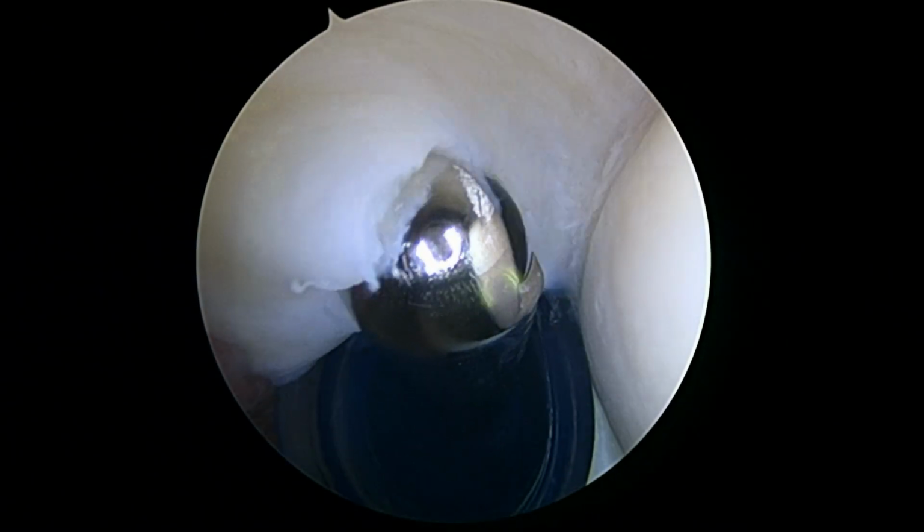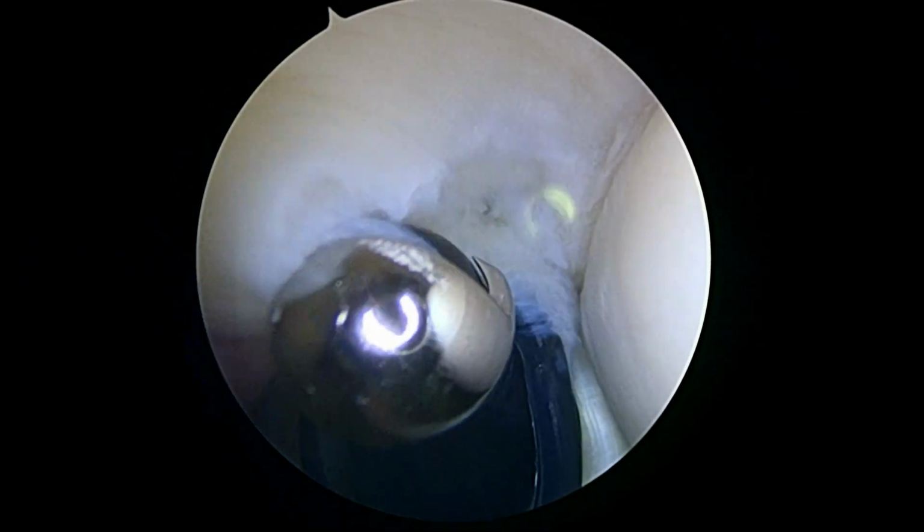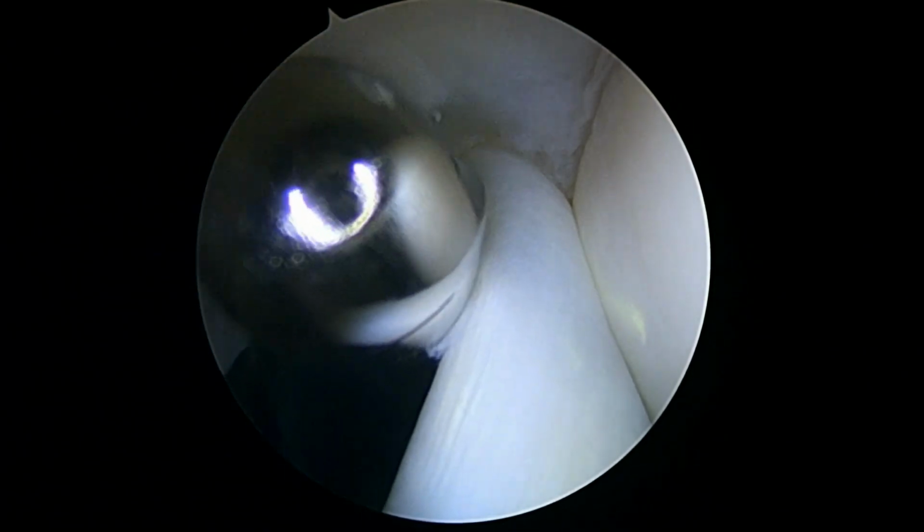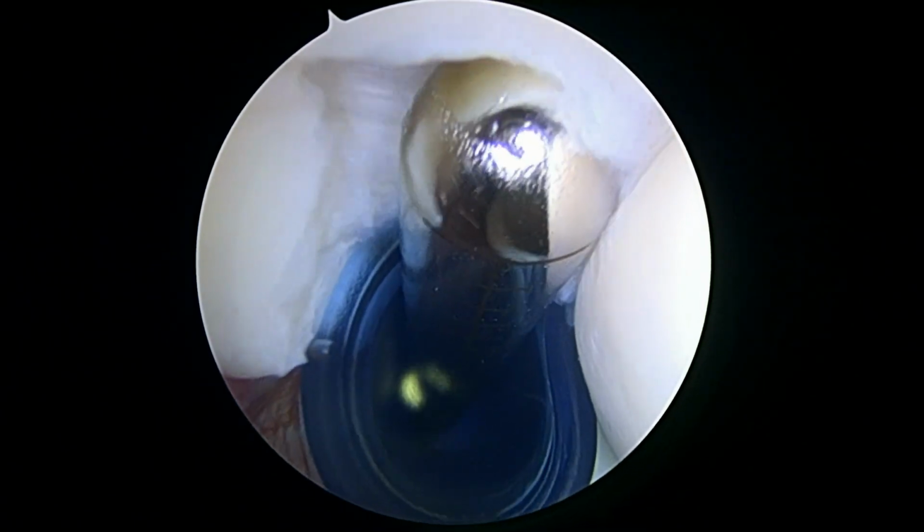We can go ahead and open up our cuff anchors and stuff. We're going to put in a shaver here, and this allows us to clean up the part that's torn and have a real good idea of how much of a repair we're going to have to do. This is pretty much what we expected to find. And the good news is it looks like your biceps tendon is okay.